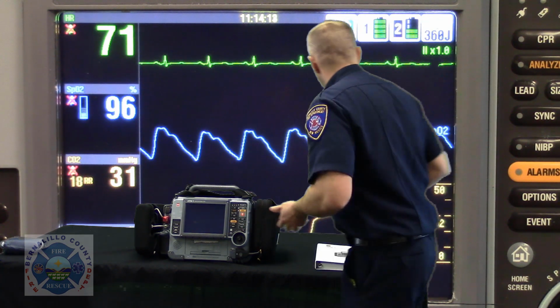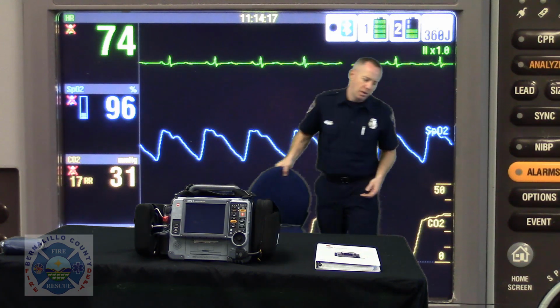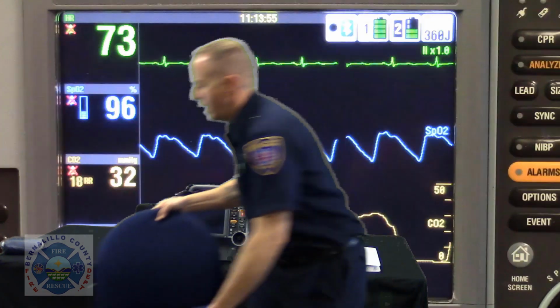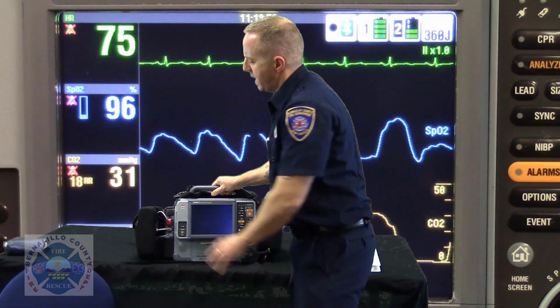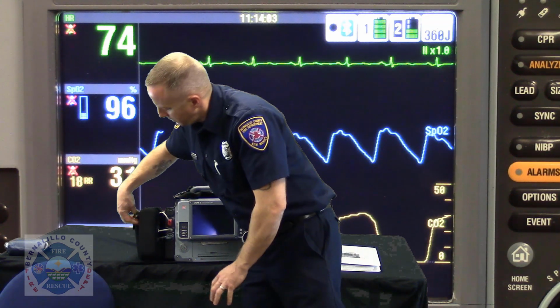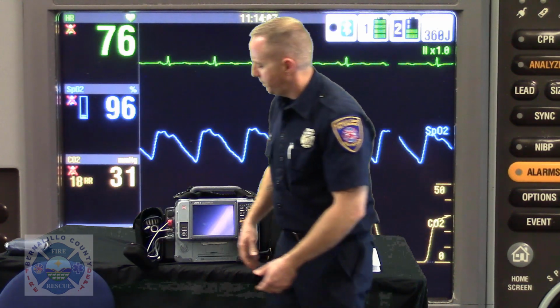So my suggestion is that you always set a patient in a chair or in the bed if possible, wherever you want them, and you get them comfortable and stationary. This allows all the cables and assessment tools to feed out from the side of the monitor and affix them to your patient.